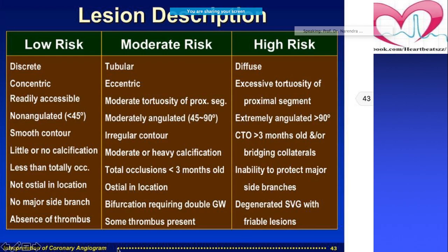In the meantime, you can try to discuss how much is the risk for the patient, how much is the problem for that patient. And by seeing your coronary angiography report, you should be able to further say, is it a low risk patient, moderate, or high risk in fact.